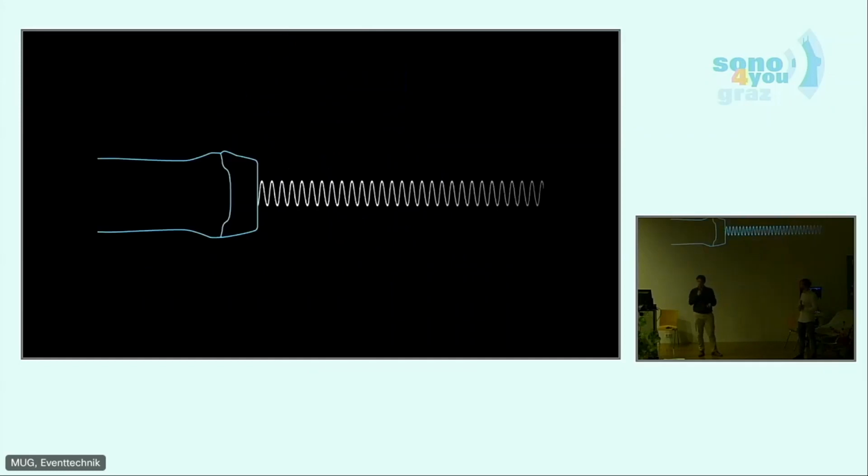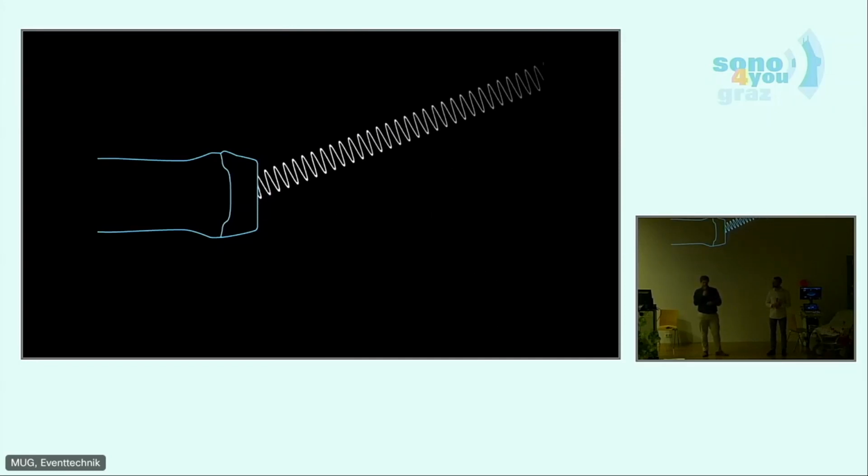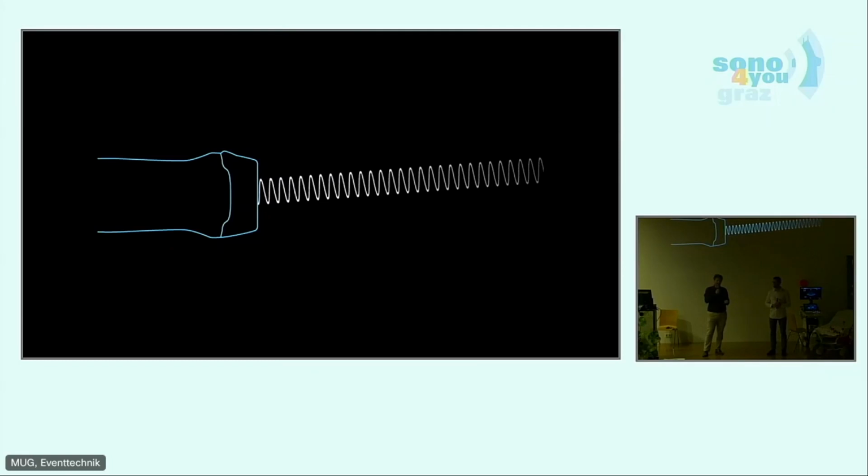Our last probe actually is the most difficult or complicated one. We have only a small contact area. And as you can see, we have only one crystal with quite a low frequency, so we get very deep inside of the tissue. But this crystal is special because it can move upwards and downwards, which is why we still get quite a big image. Romeo, can you imagine on which body surface we should use that kind of probe?